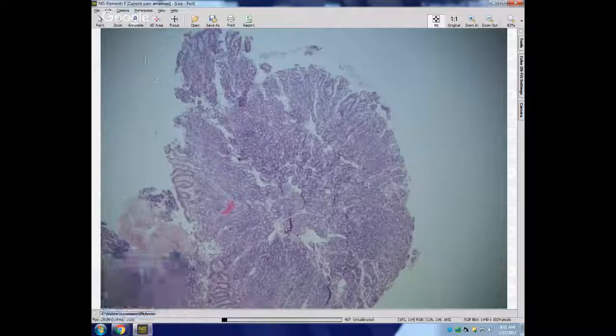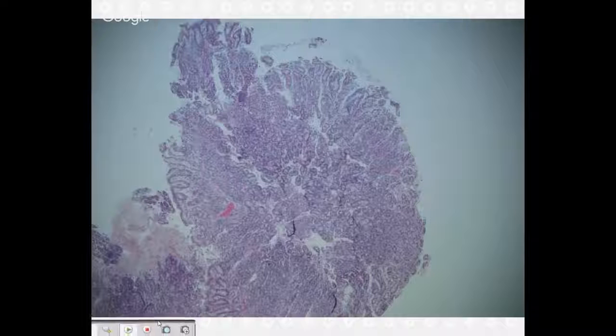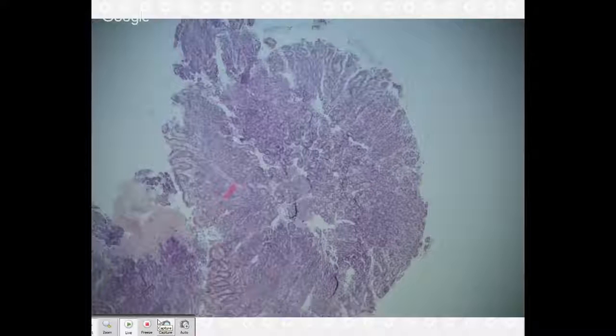Discussion for board stuff, but also pretty practical life examples. So not necessarily super zebras, but things you may actually encounter in your practice. So this first one, I didn't give y'all much history. A 62-year-old woman with abdominal pain, and I don't know names, but I would love to hear your thoughts.